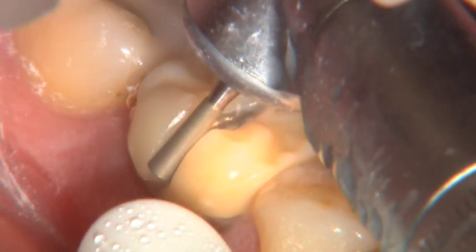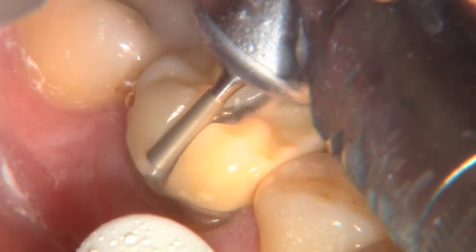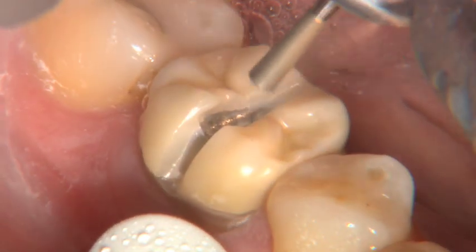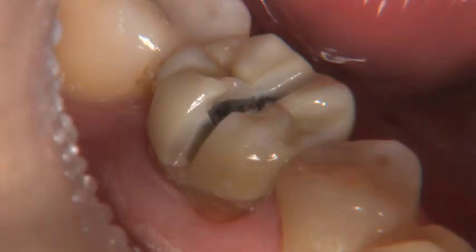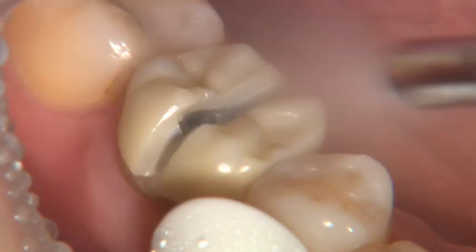It's not that difficult to see. The shape of the bur here is not that important. I'm using a bur with a wider tip because it's a supra-gingival margin. I go to a tapered narrow tip bur when I'm really close to the gingiva.